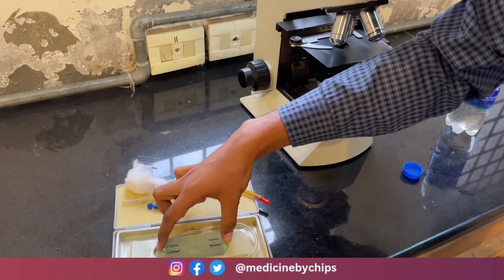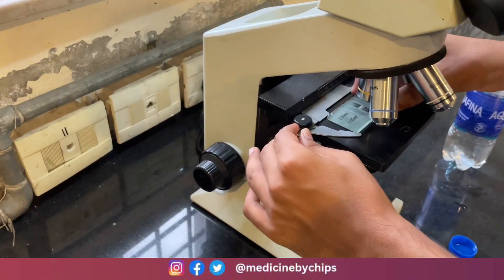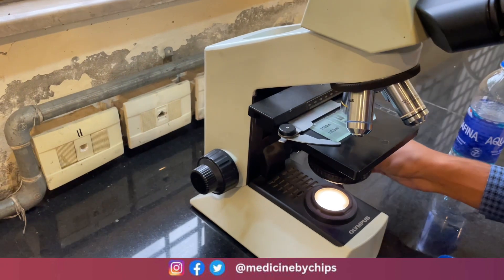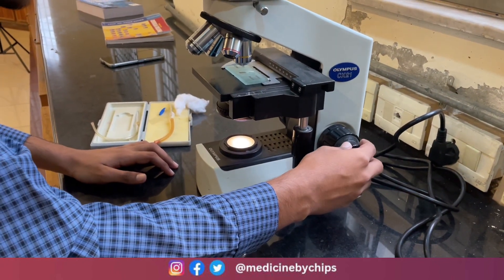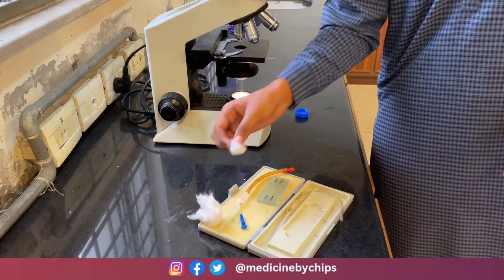The next step is to focus the Neubauer chamber under the microscope. We will focus the Neubauer chamber at 10x. After we have done the fine focus on the Neubauer chamber, we will take it out for charging it with the blood.